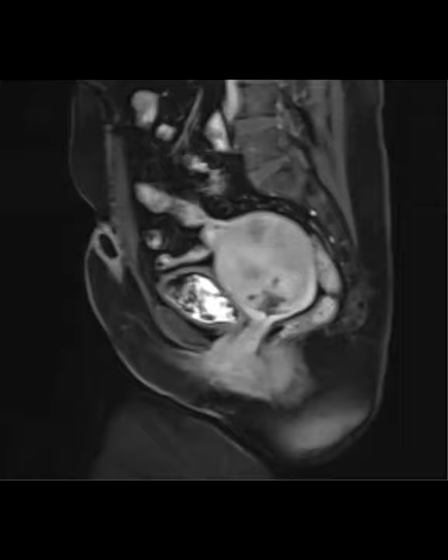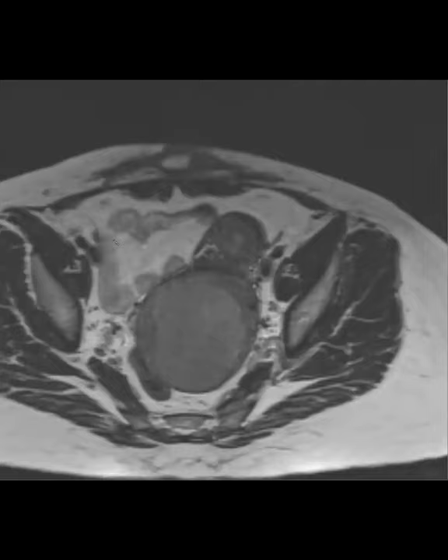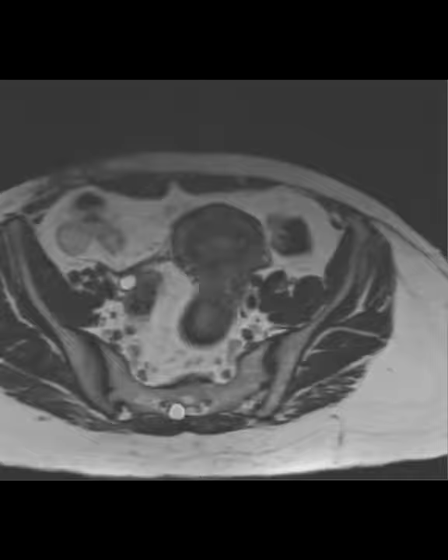I'll give you a clue. It's not a squamous or adenocarcinoma of the cervix. And can somebody just read the chat to me because I can't see it? Christine said prolapsed fibroid. Good. That's a great thought. And actually, that is something we were thinking about. We would have liked it to be even darker. If it was even darker, like darker than the muscle, we would have definitely felt that this could be a fibroid, and we brought up a fibroid.